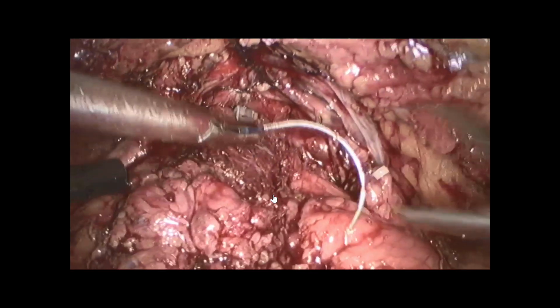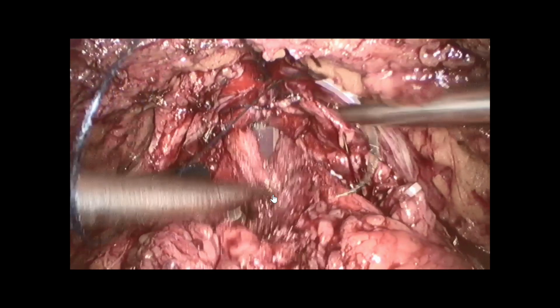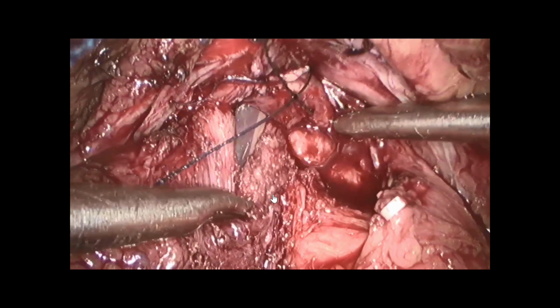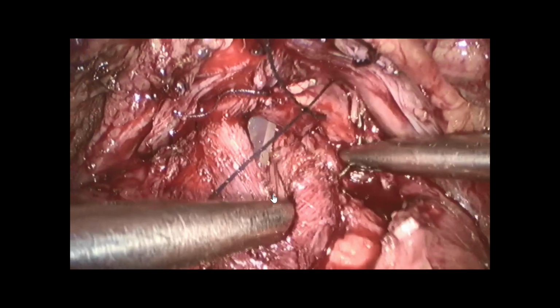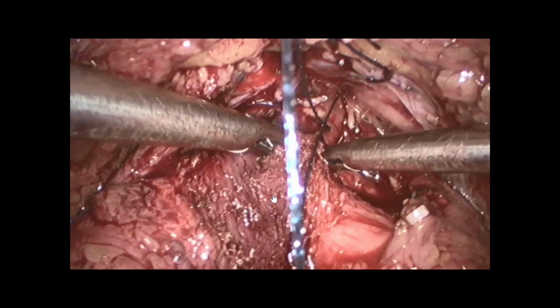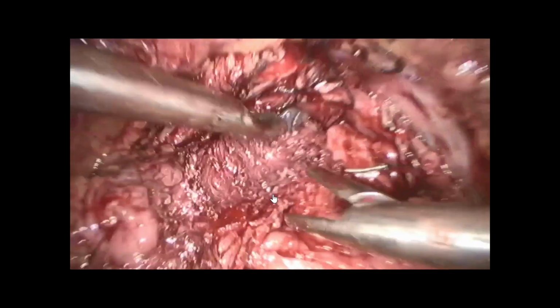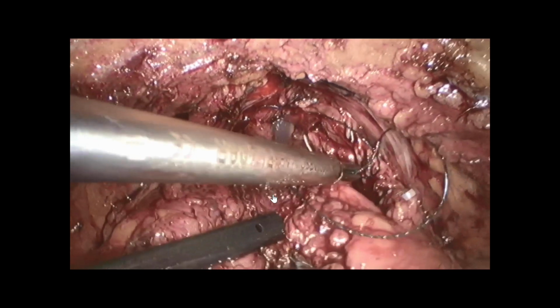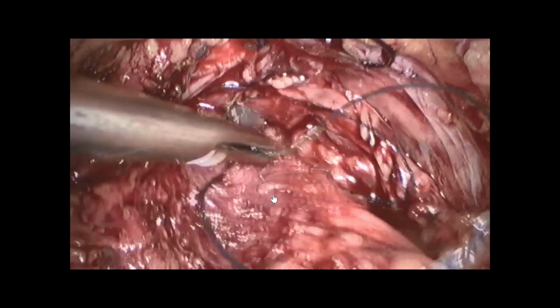And what is important here is to refix anteriorly at the end everything also. So that means that I will finish the anastomosis, and I will refix totally the bladder anteriorly.